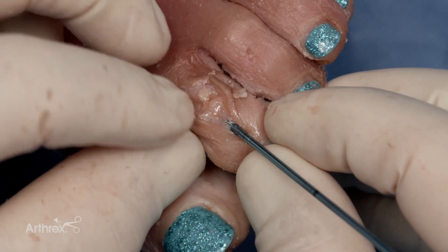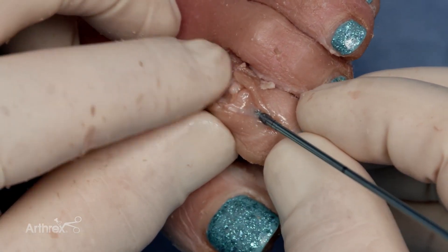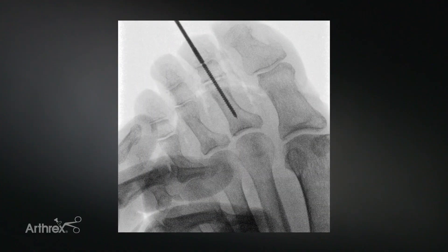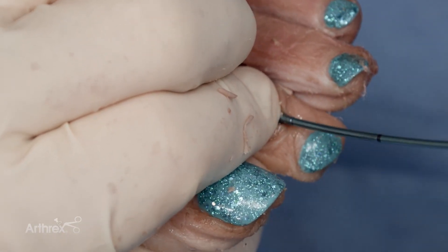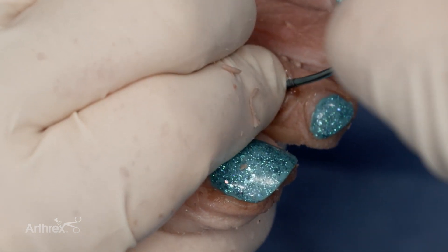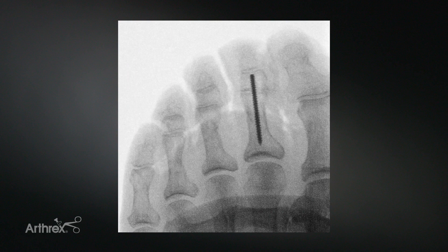The break-off point of the pin should be proximal to the distal interphalangeal joint. This can be confirmed radiographically. This pin will be slightly advanced, then snapped off. When doing this, one needs to provide a fulcrum at the base of the snap-off point. The radiograph shows the final implanted snap-off pin. This is a low-profile intraosseous pin that provides compression across the arthrodesis site and maintains motion of the distal interphalangeal joint.